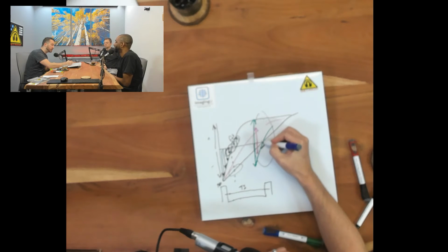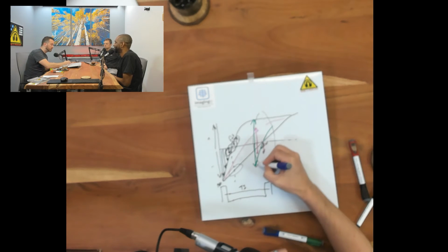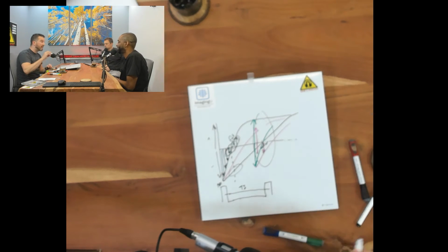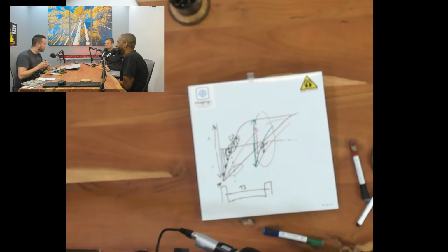Then only myocardium, which is relaxing slower, still has that much magnetization playing the game, so the 90-degree excitation pulse will flip that into the transverse plane. Meanwhile, water, or inflowing blood, is going to be dark. So we have a really cool contrast between the bright myocardium and the dark blood.